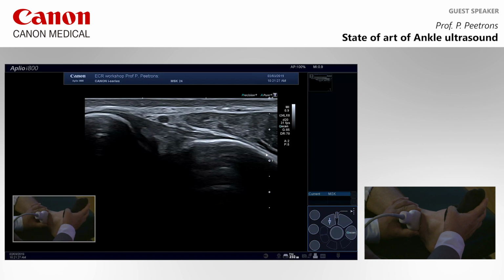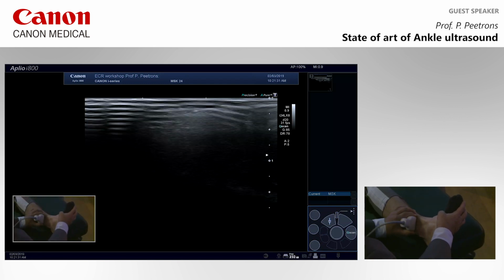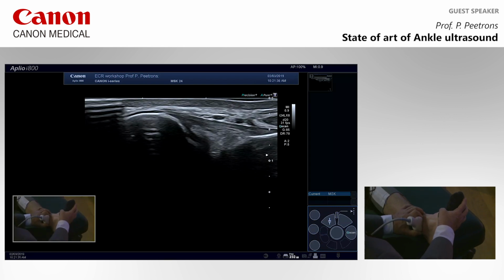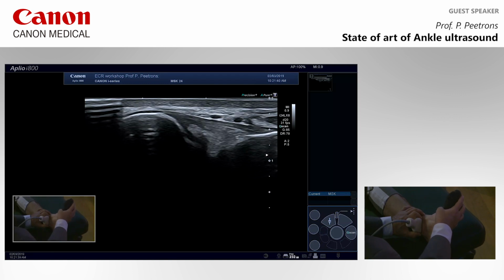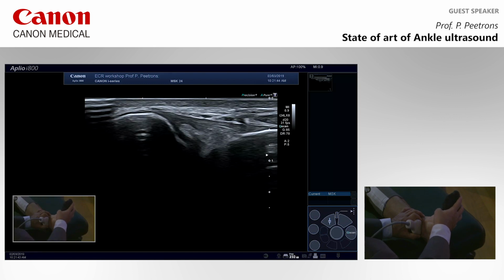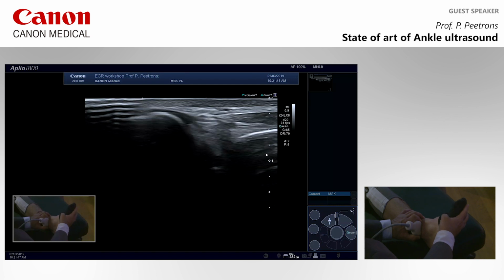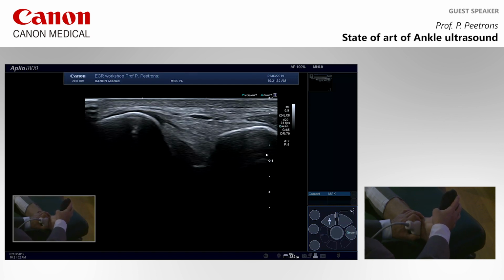So this is what I will do. I will do it myself, and sometimes you can see a little difference. I need a little bit more, voila. So this is without tension, and this is with tension. And you see the ligament better with tension, of course, than without. So if you don't see the ligament very clearly, don't forget to put the foot in dorsal flexion.